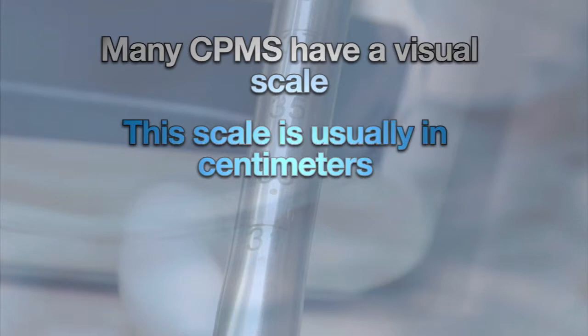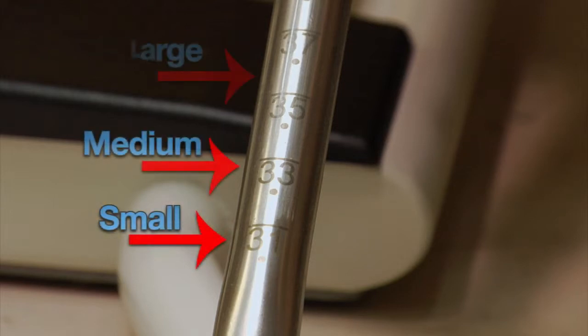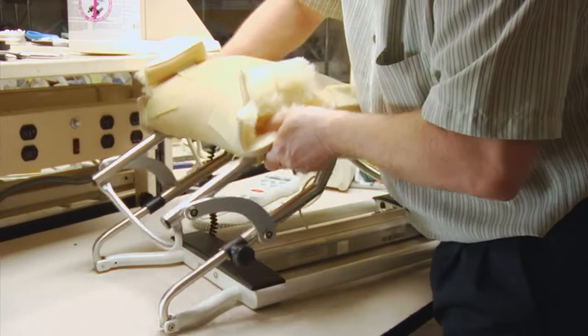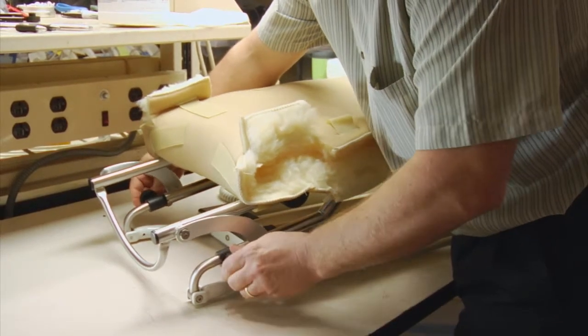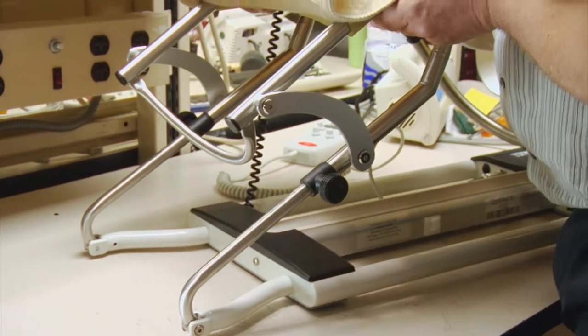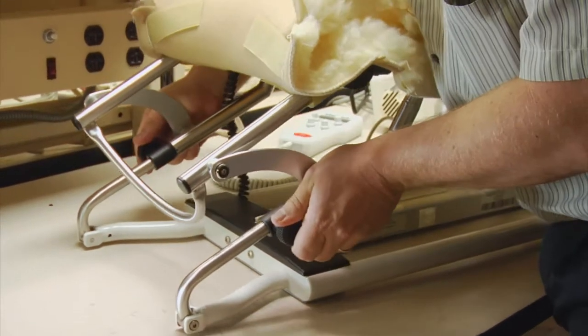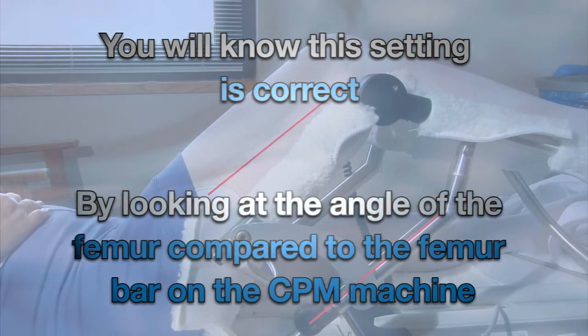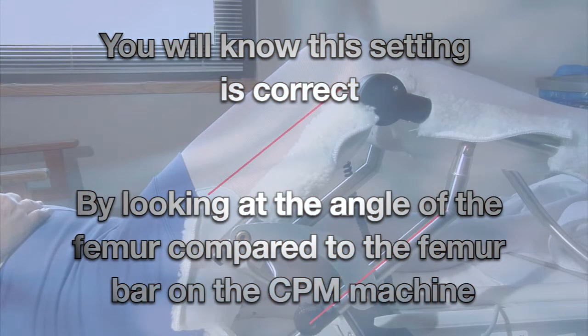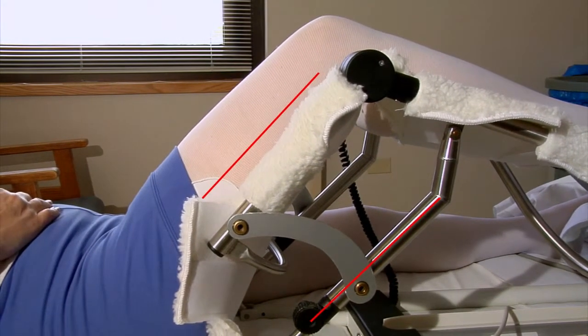If no visual scale is present on your CPM machine, adjust the femur length for 3 settings: small, medium, or large. If your patient has a short leg, adjust the femur length to its shortest setting. Or, if your patient has a longer leg, extend the femur adjustment to its longest setting. A CPM machine set in the middle range will fit the majority of your patients. You will be able to verify that this setting is correct by looking at the angle of the patient's femur compared to the angle of the femur bar on the CPM machine. The leg should be parallel with this bar as it moves into greater flexion angles.